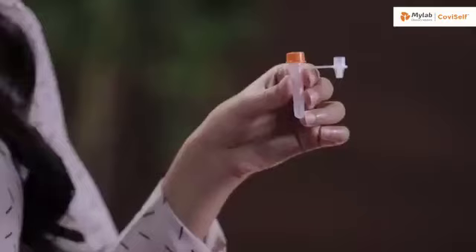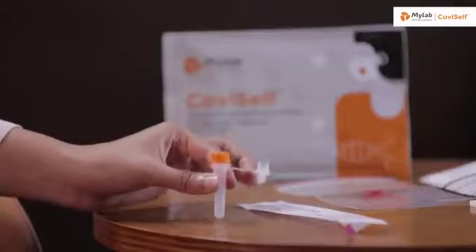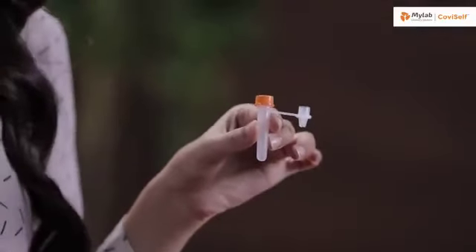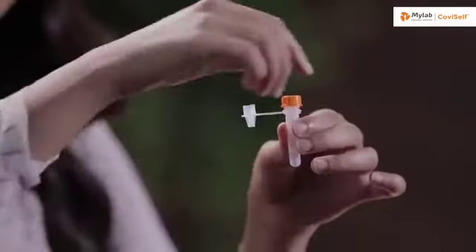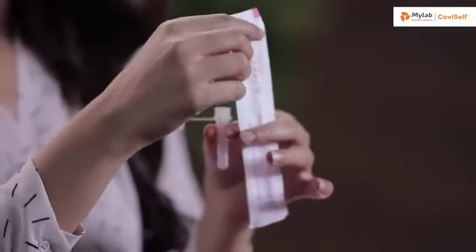Let's begin with the test. Take the pre-filled extraction tube and tap it gently three or four times to ensure that the liquid settles at the bottom. Unscrew the cap and hold the tube in your hand. Open the sterile nasal swab while holding the tube in your hand.